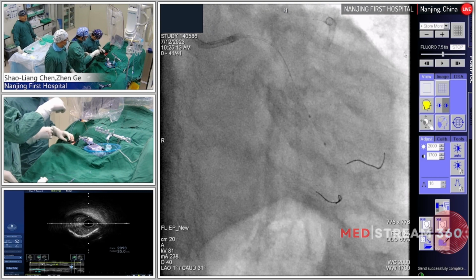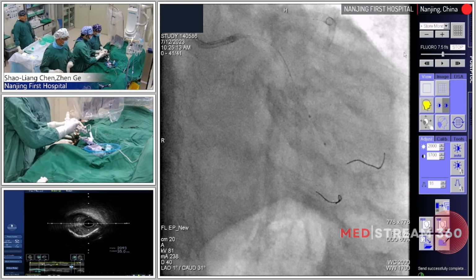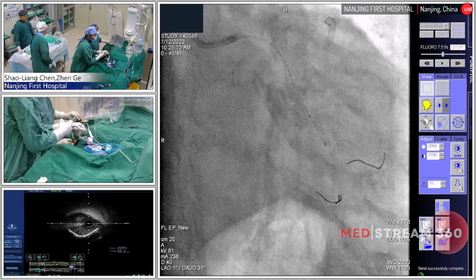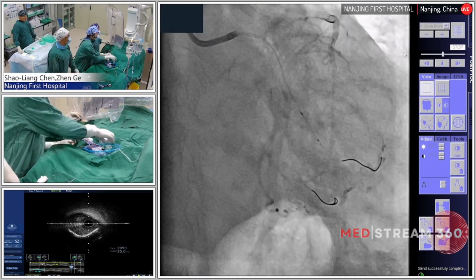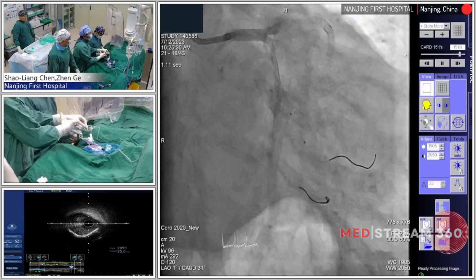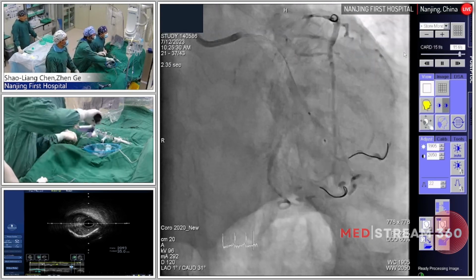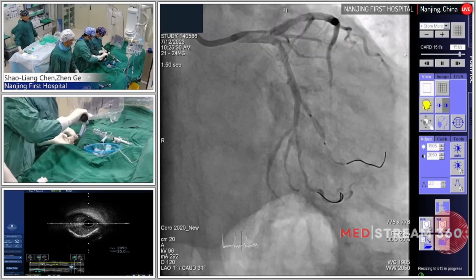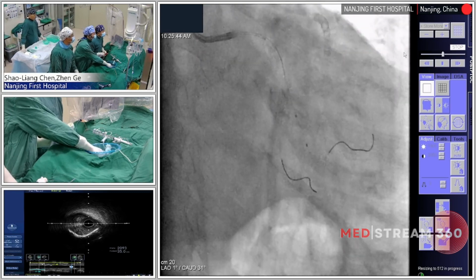So after stenting, we need to slightly withdraw the stent balloon to optimize the side branch stent. An alternative technique is to use another NC balloon to post-dilate the side stent to make sure the side branch stent is fully expanded and very well post-dilated.